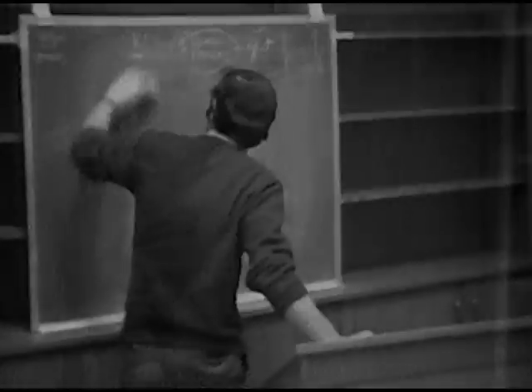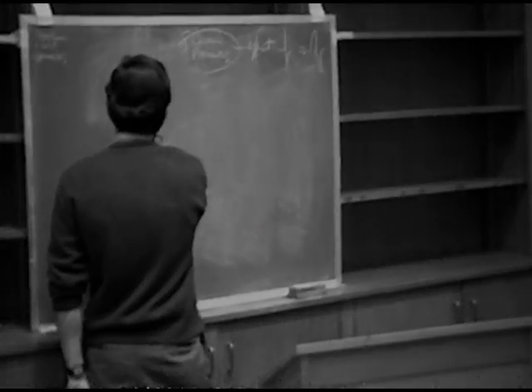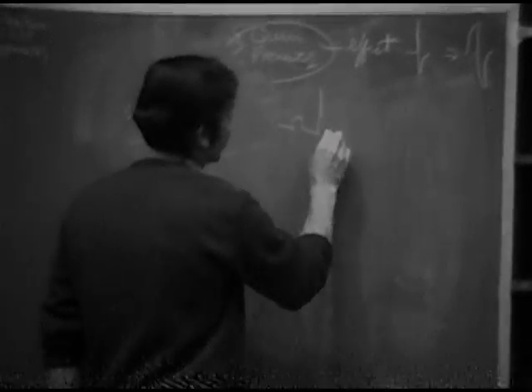Okay, now let's just go over hyperkalemia, because that does different things to the electrocardiogram. It doesn't shorten the QT interval. Normally your potassium is somewhere about 3.5 to 5.5. You have an EKG that looks like this.